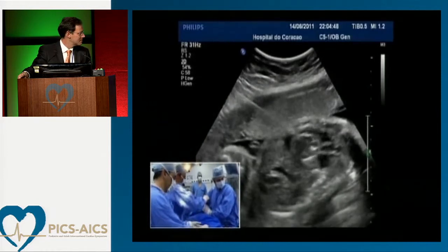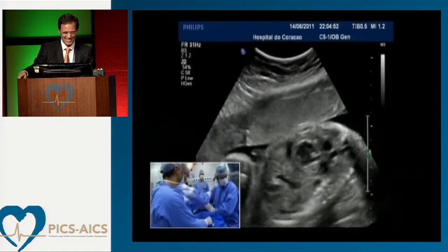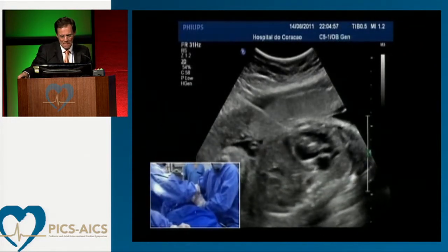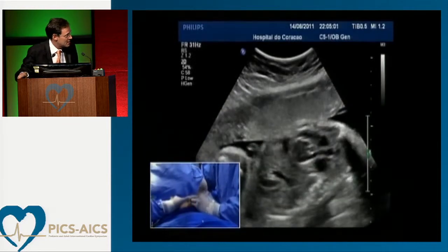Carlos, this is good. What was the LV pressure? Needle, Fabio. I'm just below the aortic valve. Whatever it takes. The pre-mounted system is here. Now, some people do that with the pressure wire, by the way. This has been done, yeah.